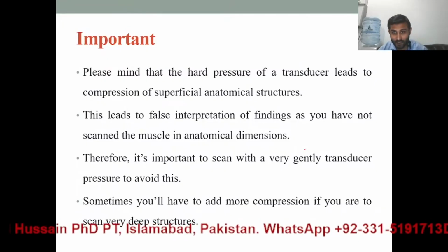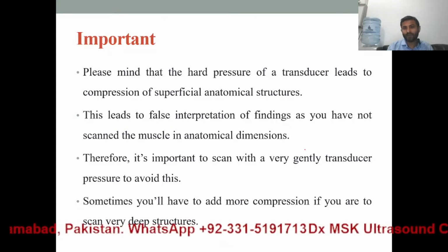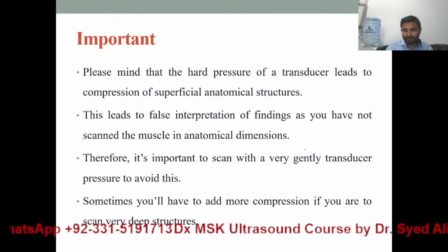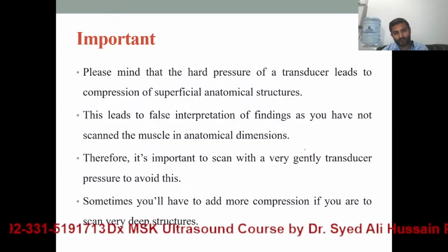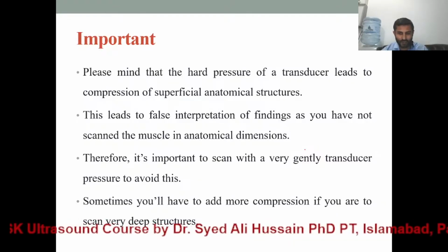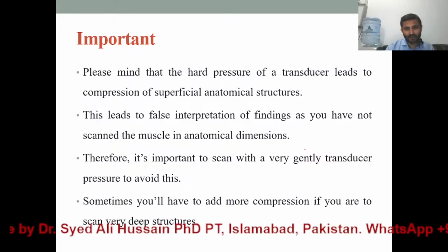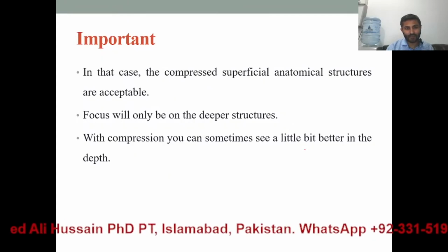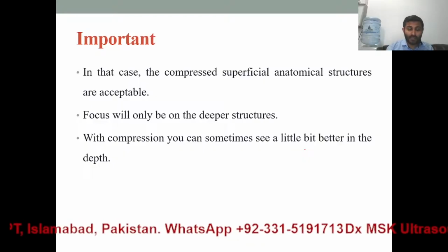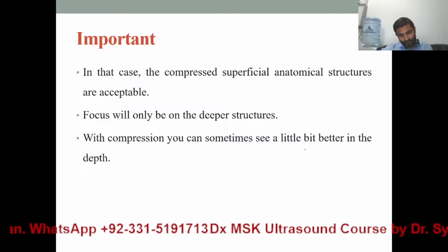Please mind that hard pressure of the transducer leads to compression of the superficial anatomical structures. So if there is any inflammation or edema, if you press too hard, it will move to the side. Therefore, it is very important to scan with the transducer very lightly. Sometimes you'll have to add more compression if you are scanning a deep muscle, and sometimes you have to use less compression. In that case, if you compress more, you will be compromising the superficial structures, and you will be focusing more on the deeper structures.